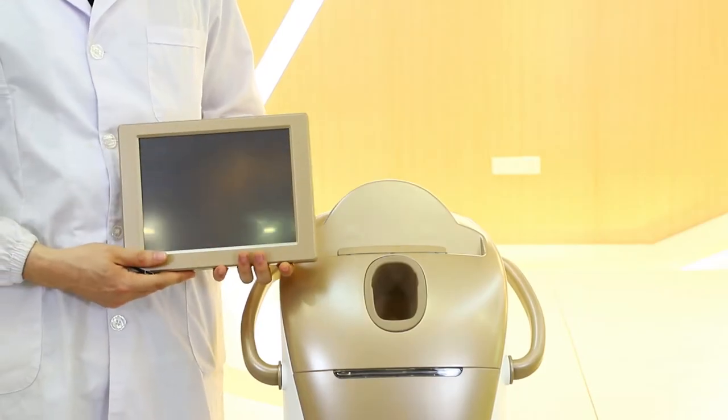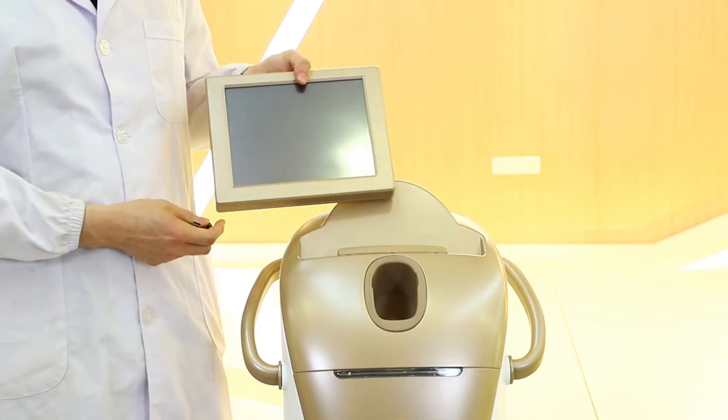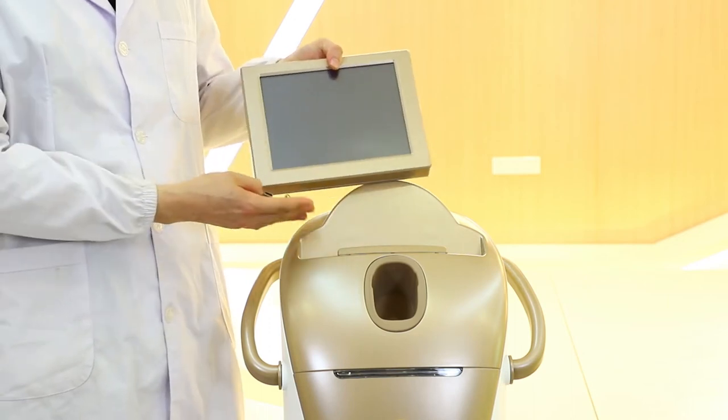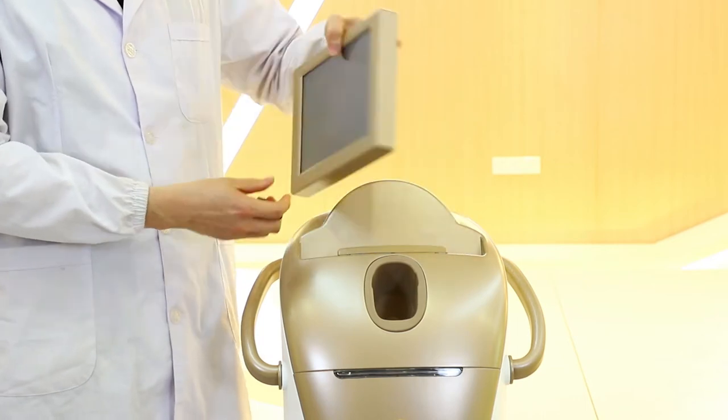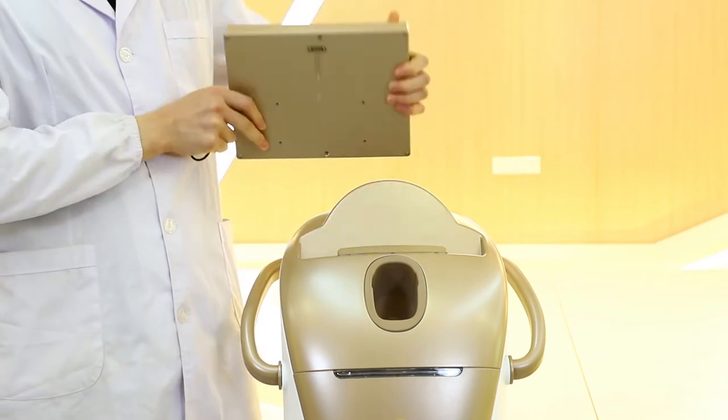Now we show the installation of the removable screen. The first thing is to place the screen in the machine. Most importantly, we do not place the machine upside down — this is the wrong way.